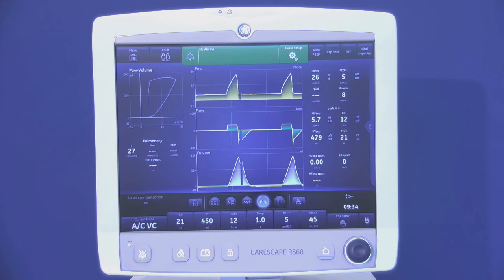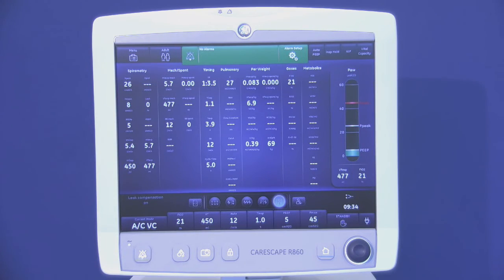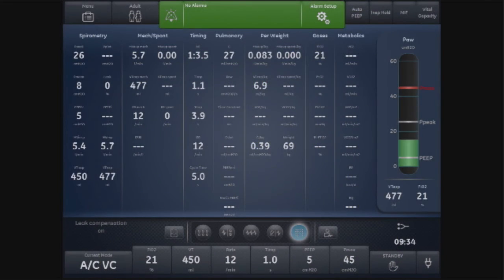To the right of the split screen view is the charting view. Use the charting view to see a complete list of measured patient data. The airway pressure bar is permanently displayed to easily view patient airway and pressure settings, tidal volume, and FiO2. The charting view is organized into segmented, categorized columns. This is ideal for reviewing data during the patient ventilator assessment.